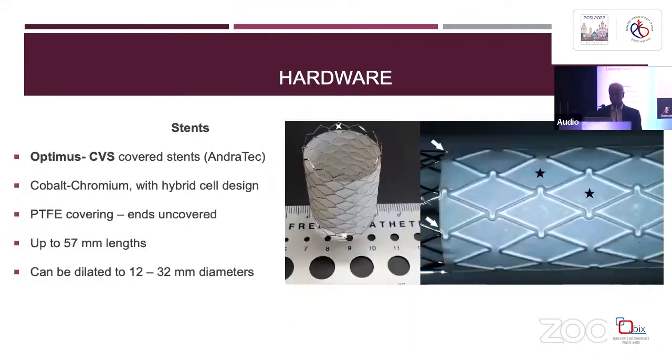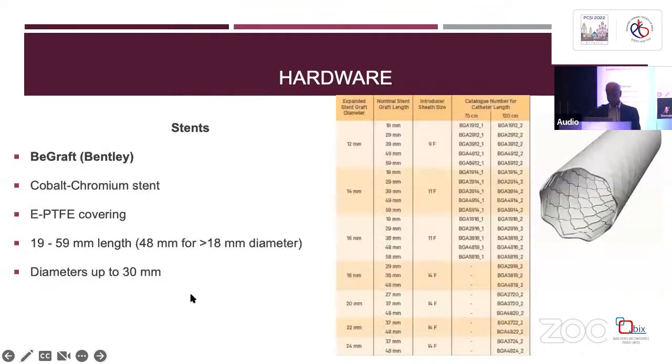The Optimus CVS from Andratech, fairly similar, cobalt chromium with hybrid cell design. There's closed cell combined with open cells seen here. PTFE covering, again, it's up to 57 millimeters long and can be dilated up to 32 millimeters diameter.